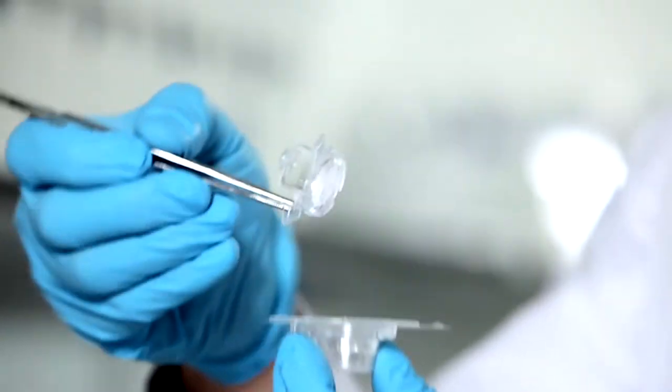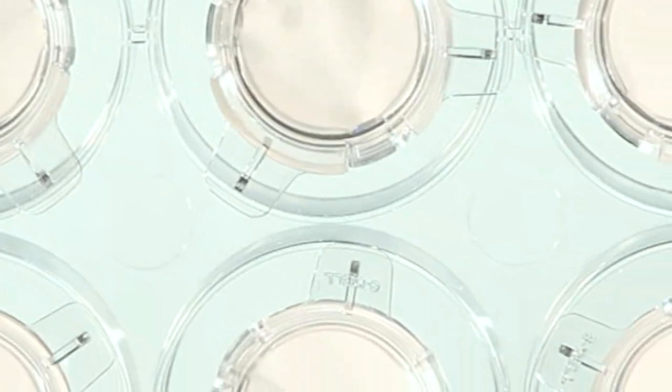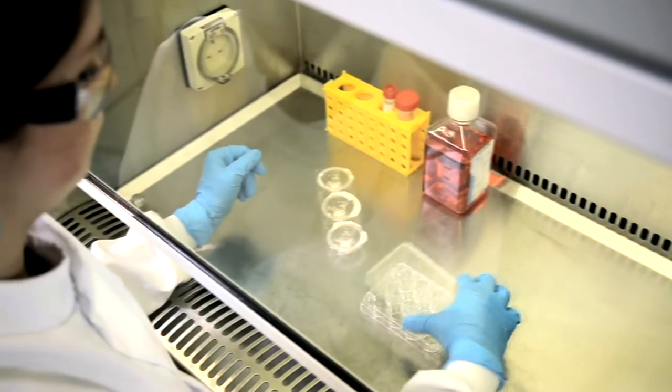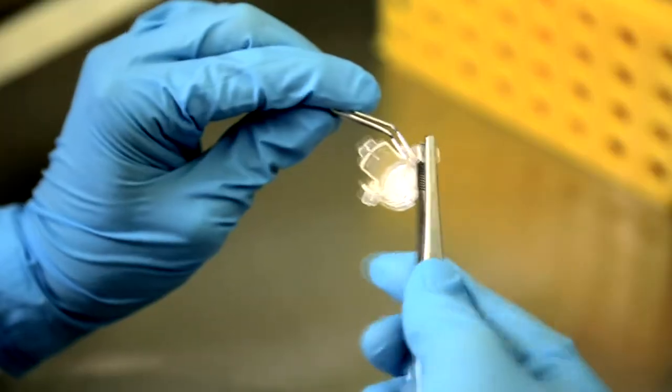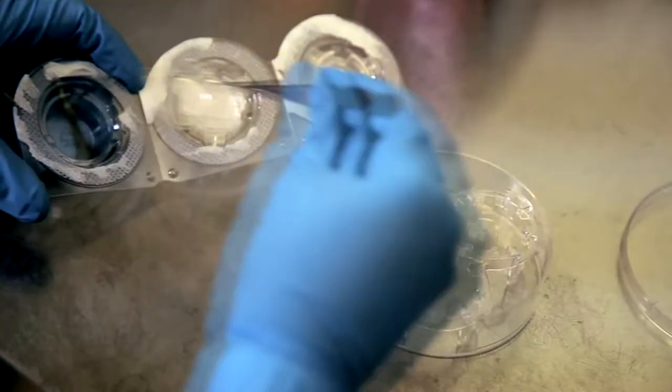Our well inserts are easy to use and are highly versatile. They're available for 6 and 12 well plates and as large volume Petri dishes. Our well inserts fit a range of culture plates from different manufacturers. The 12 well insert can fit into both a 6 and 12 well plate, as well as a Petri dish.